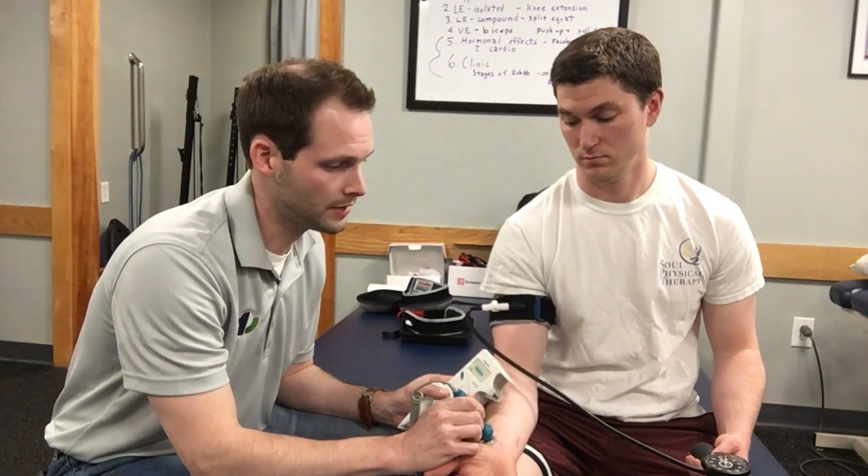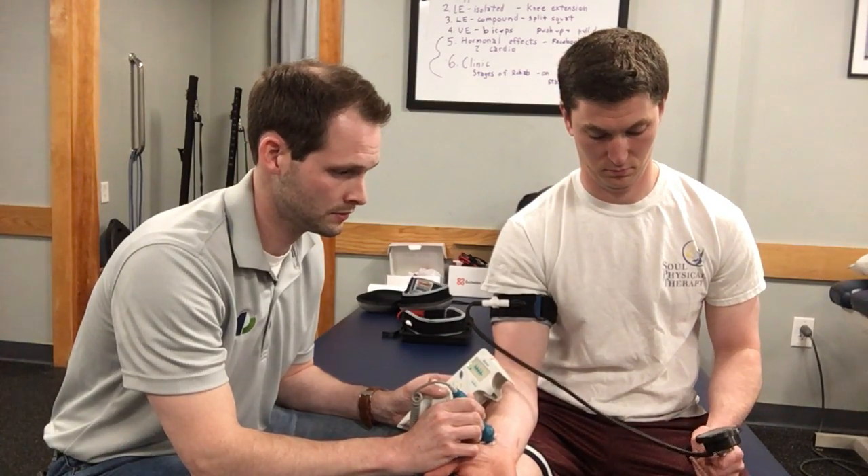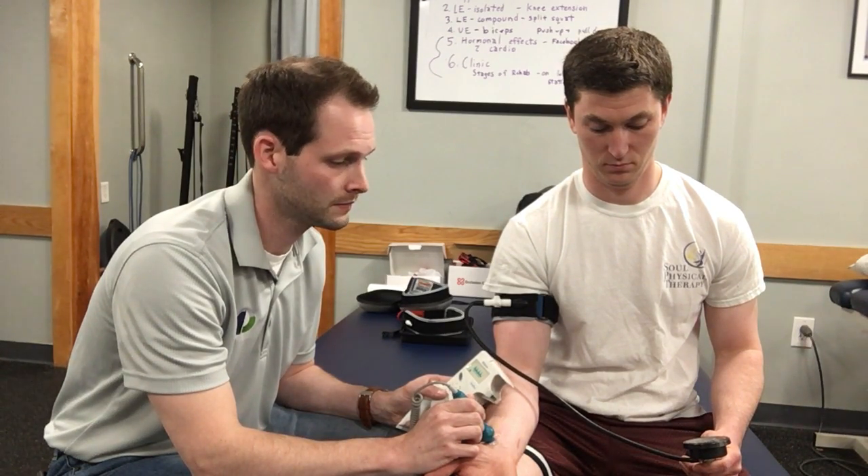I'm going to have Andy — or I would have the patient — start pumping up the cuff band, and then you start to hear the signal go away. Then I would have the person start to deflate it slowly and listen for when the blood flow starts to come back.